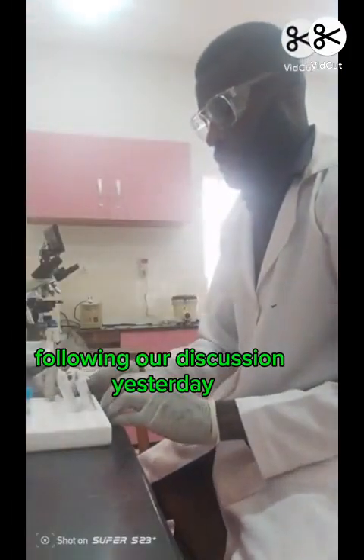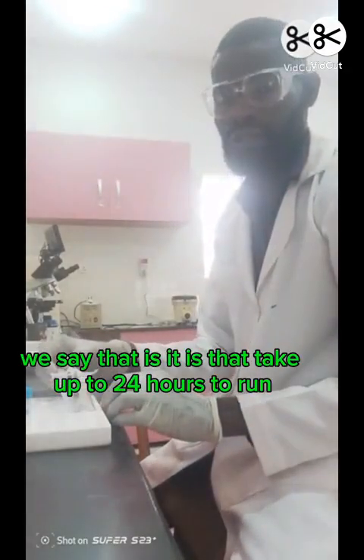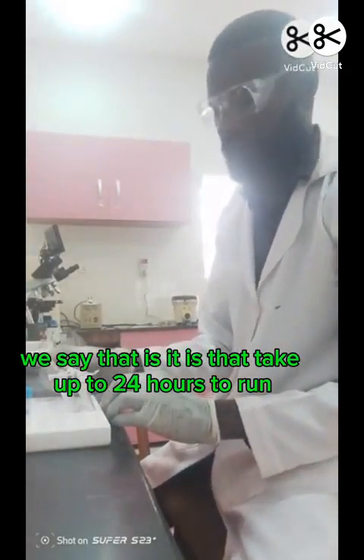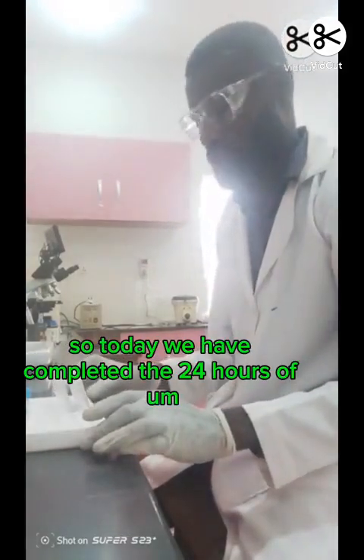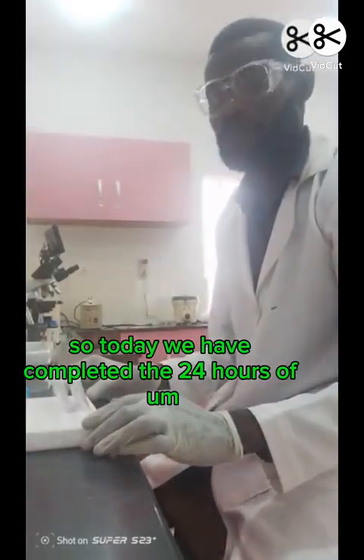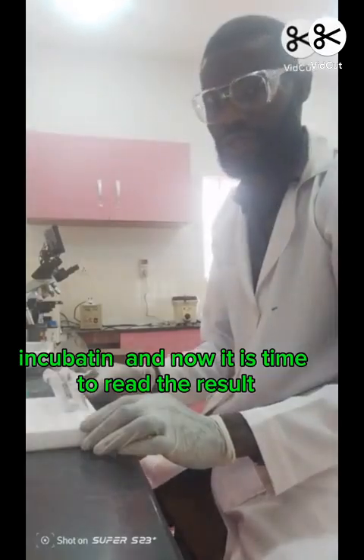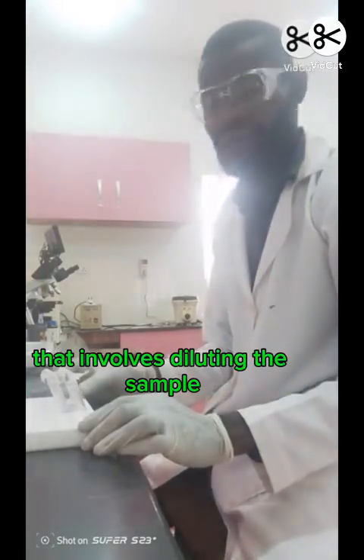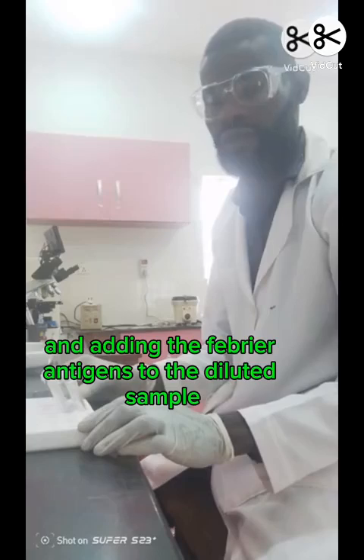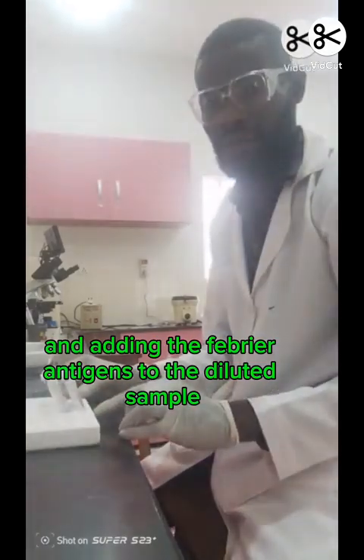Following our discussion yesterday, talking about the tube test for Widal diagnosis, we said that it's a test that takes up to 24 hours to run. So today we have completed the 24 hours of incubation, and now it is time to read the result. Remember, it is a serial dilution process that involves diluting the sample and adding the febrile antigen to the diluted sample.